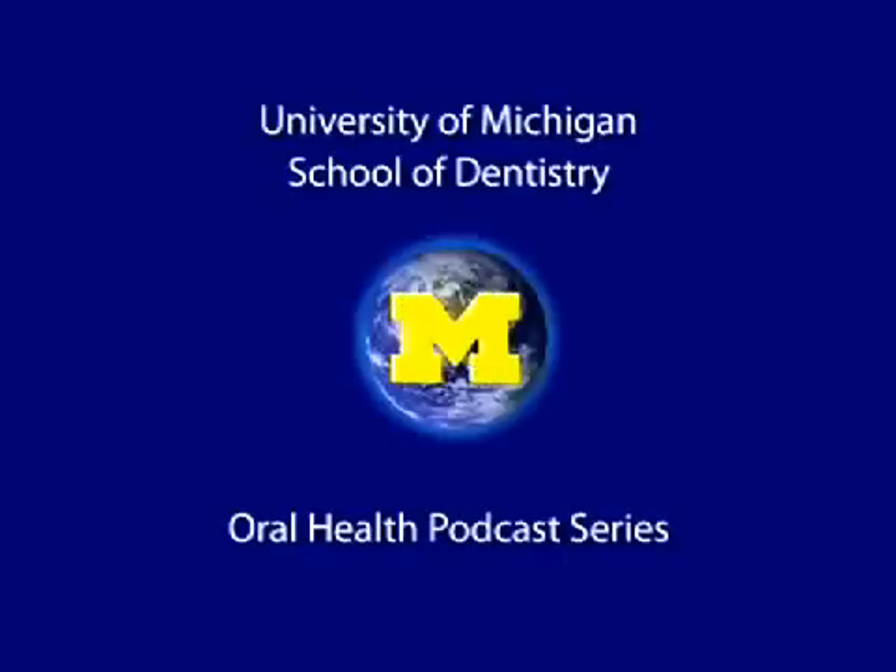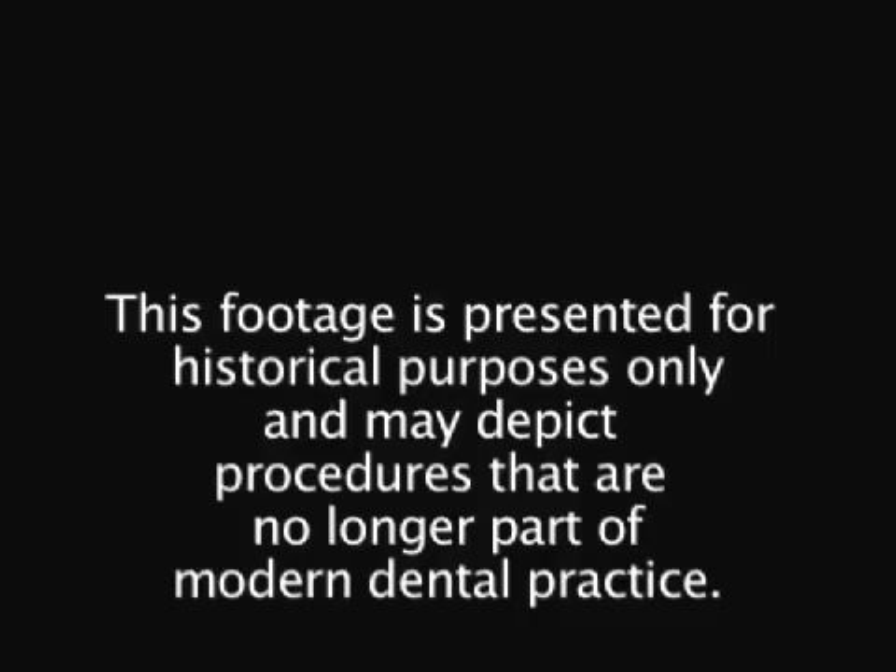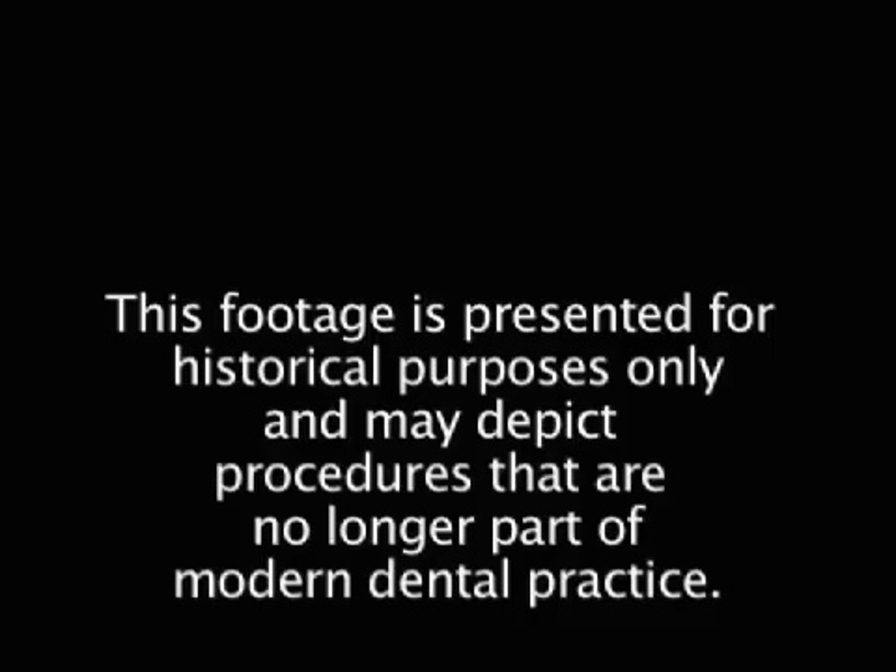Welcome to the University of Michigan Dentistry Podcast Series, promoting oral health care worldwide. In employing hygroscopic or thermal expanding technique for dental gold castings, one may invest the wax pattern using vacuum investing technique, as you have been doing, or one may use hand painting technique. We would like to show you how the hand painting technique is done.